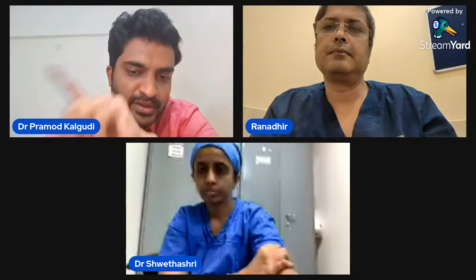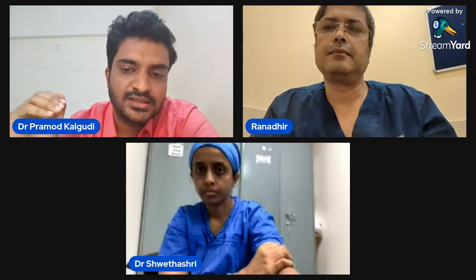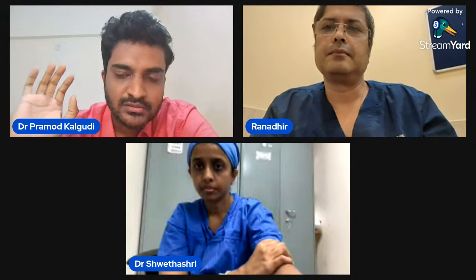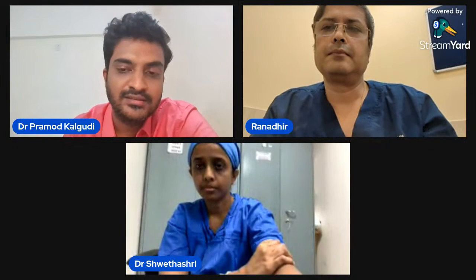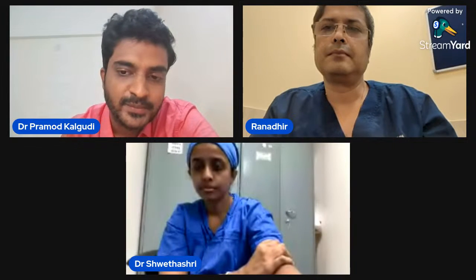So as soon as you press that, all the settings which will help you to visualize a vein better will be automatically adjusted by the system itself. All that you need to do is get a good window. Things are advanced so much that it's quite easy these days, probably with the advanced machines.